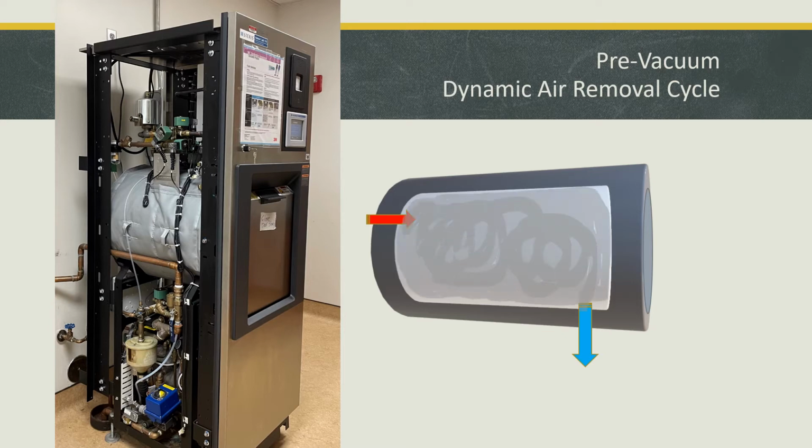will allow the steam to build up to that 27 psi, 270 degrees, so the chamber completely fills at that point. Now, at this part of the pre-vac cycle, we've already gone through those conditioning pulses of steam entering and then being vacuumed out, pulling negative. And when we've done that 3-4 times, then when we start the actual sterilization cycle, we get much better penetration.